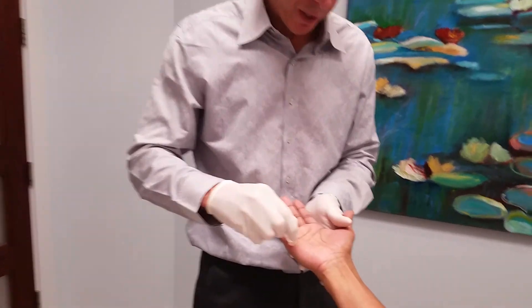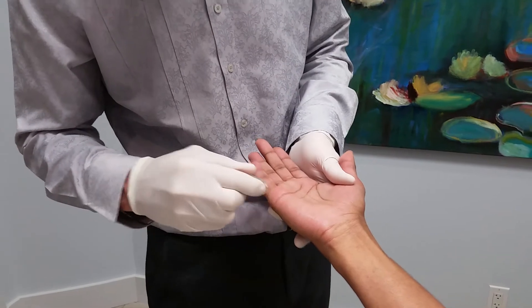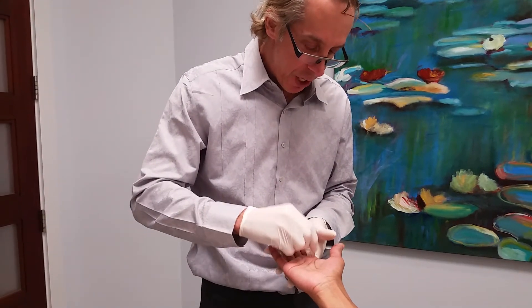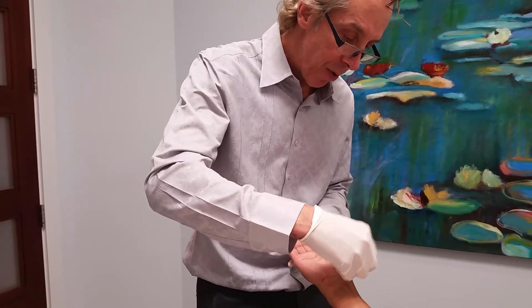We have no topical anesthesia on the hand, and this gentleman says it's pain-free. We inject a little bit of Botox along his fingers and everywhere he has sweat, and it allows us to inject less dysport because we're more accurately placing it and it's going to be more uniform as well.